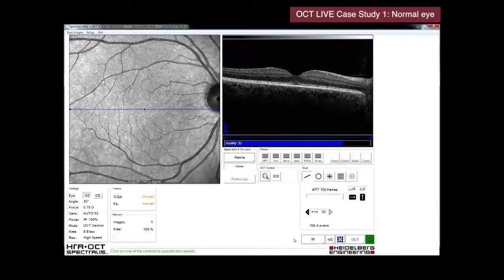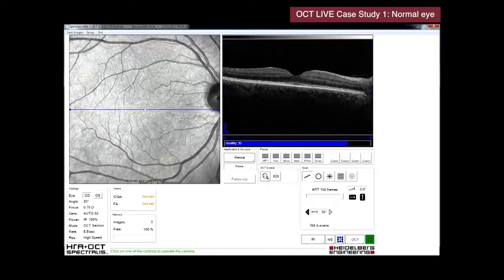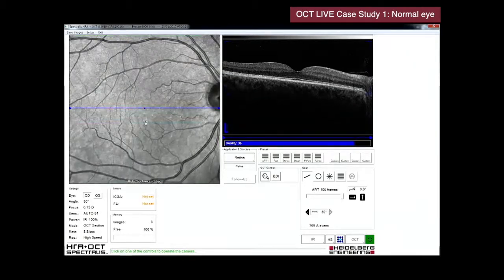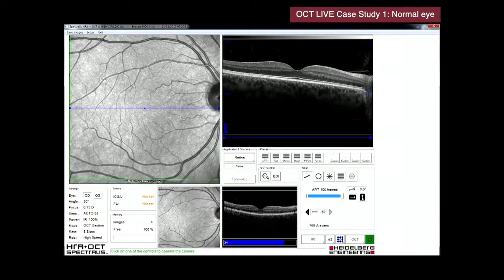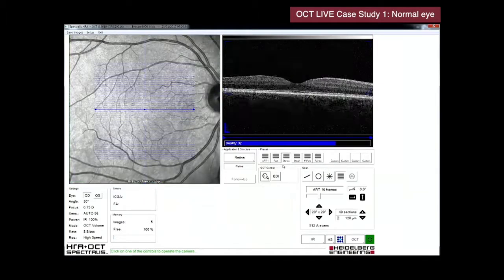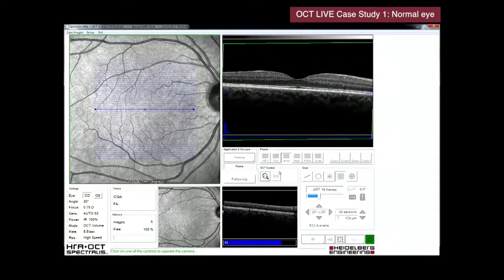The first thing to do is to identify the central fovea. What we're looking for is this shallow depression. And note the bright reflex at the center of the fovea. This means we've got a foveal-centered scan. We're then doing a scan in a vertical orientation. What we're looking for here again is any structure that's going to conform to the midline. So if you've got a vascular occlusion, or in glaucoma you see arcuate retinal fiber loss, doing a vertically orientated scan allows us to identify change.